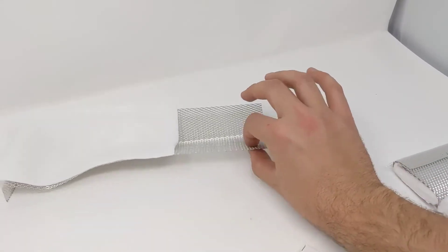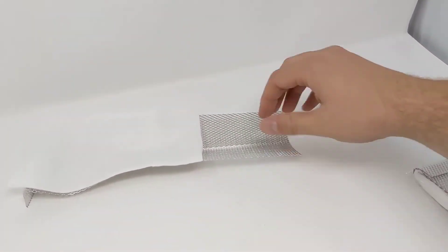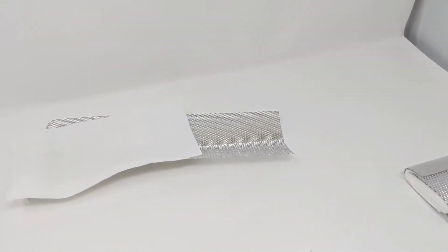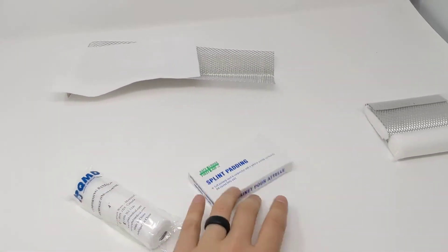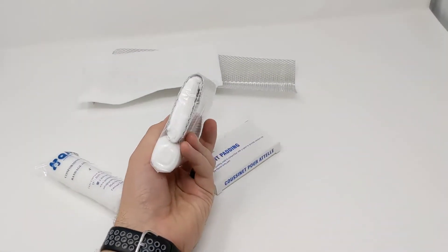You could definitely carry multiple sheets of this and attach them together by bending and overlapping them to make a larger splint as needed. So that's our wire splint, our splint padding, and just an example of an ultralight splint kit.